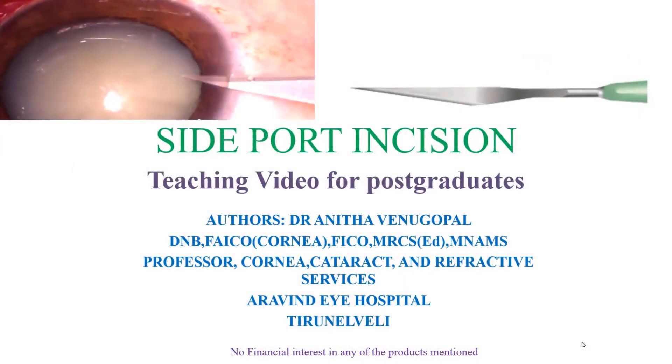The side port incision made in manual small incision cataract surgery may appear as a small and trivial step, but it has great significance for a successful surgery. Here is a teaching video on proper side port construction for learning postgraduates.